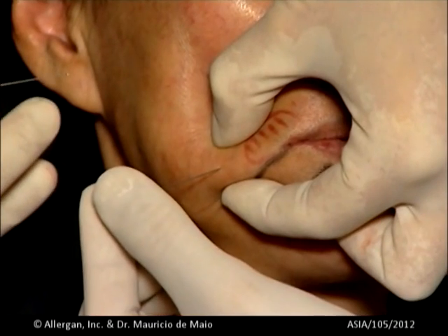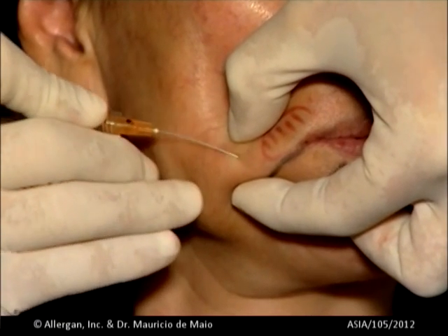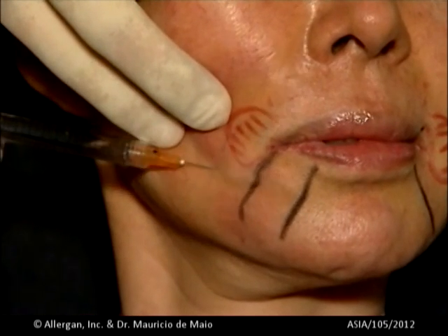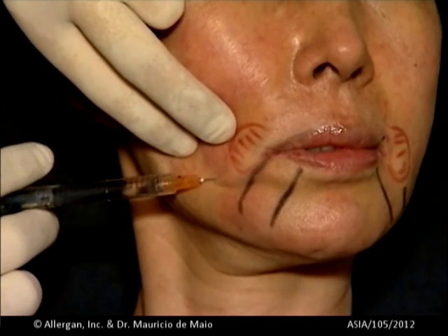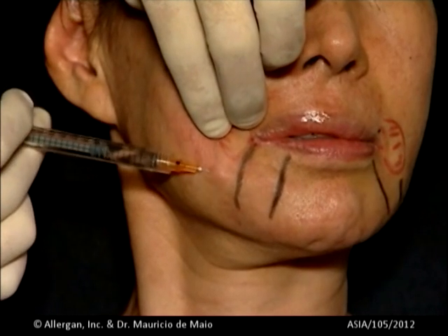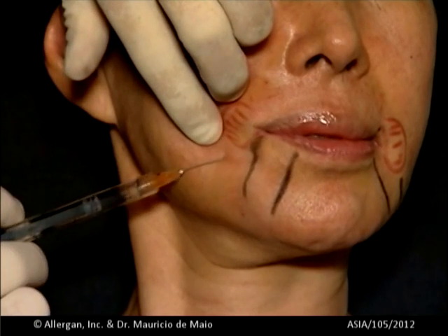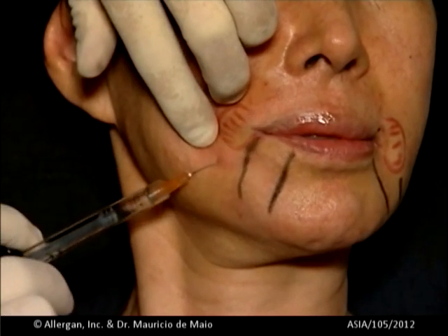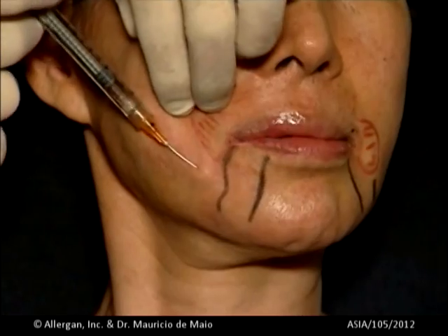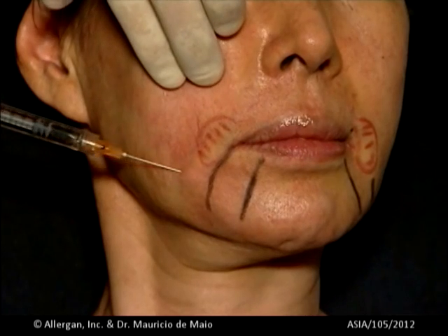And use Voluma with a 25 gauge cannula. Stretch the skin and direct to the area of volume loss. Proceed with fanning technique or retrograde and anterograde, and display the product in multiple layers so that we can give support to the more superficial areas around the perioral. We may also proceed and put the cannula in the chin, which would be point number 9.